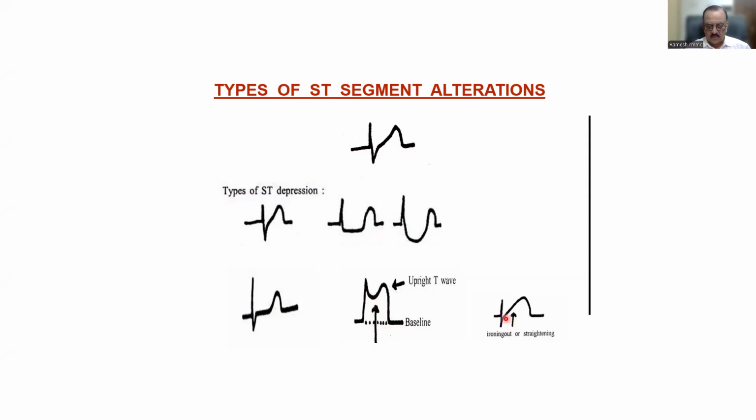See this ST segment. Do you think this ST segment is normal or abnormal? Concentrate on the ST segment. Don't look at other things. No concavity, sir. Concavity is not there, but elevated. Excellent, superb. There is no concavity. Otherwise, it looks so normal. Q, R, S, T, everything looks normal. What is not there? The gentle concavity is not there.